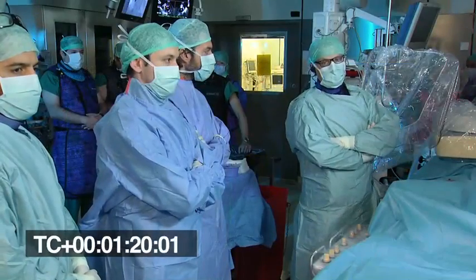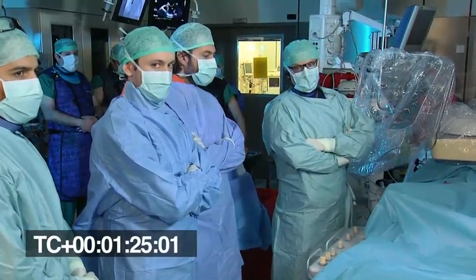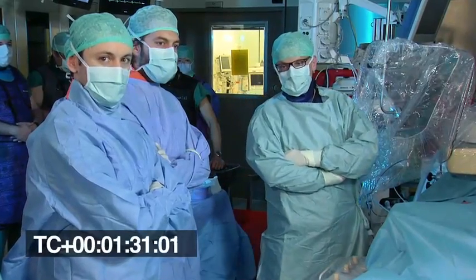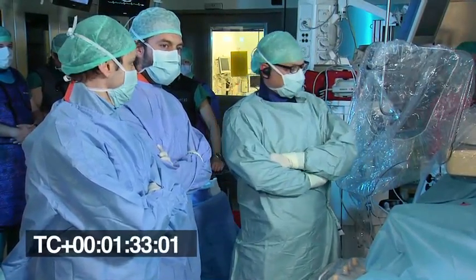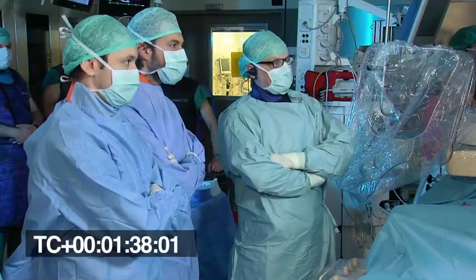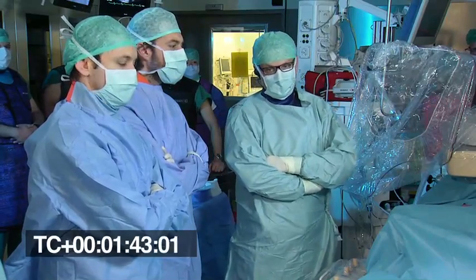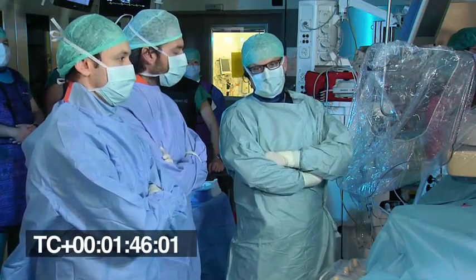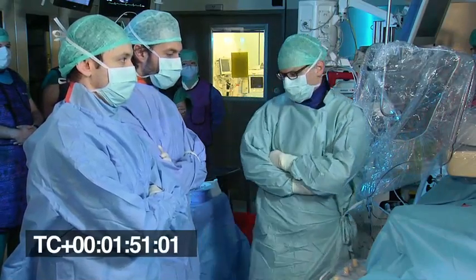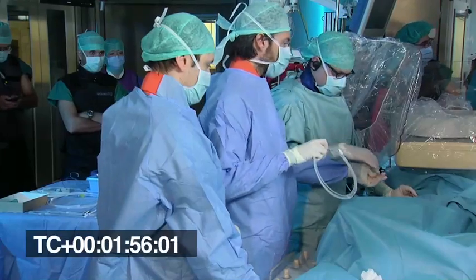Welcome to the hybrid operating room in our institution. I'm here with Dr. Taramasso — you already saw him before presenting the case — and with Oliver Gamperly, who is assisting us for most of the procedure. We need a team effort. In this particular case, as you have seen in the CT scan, there is a potential risk for the circumflex artery, so we need to be prepared and have everything ready for a potential bailout situation.